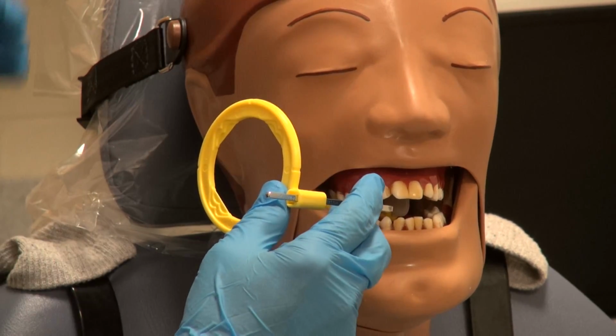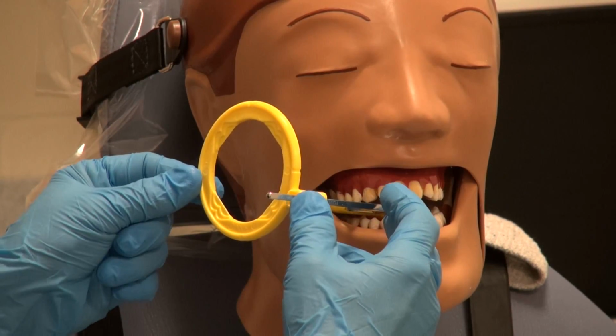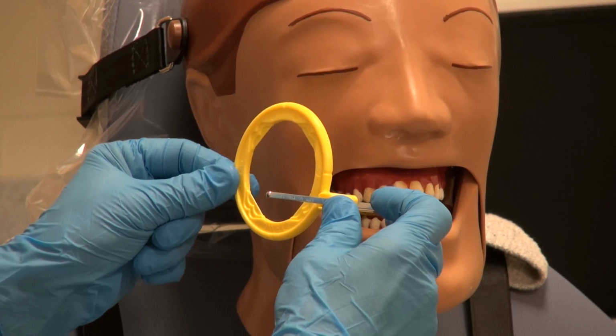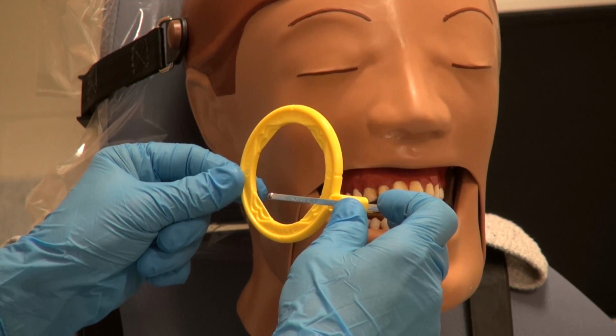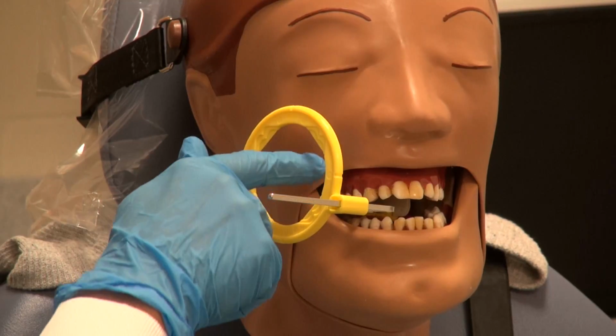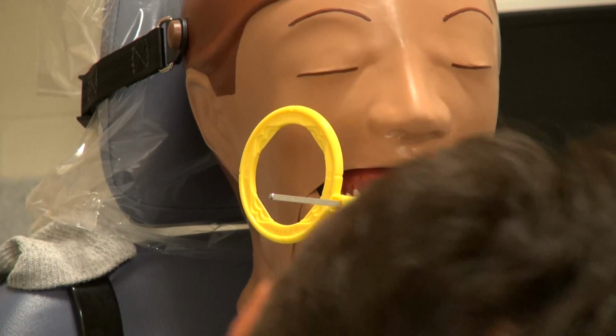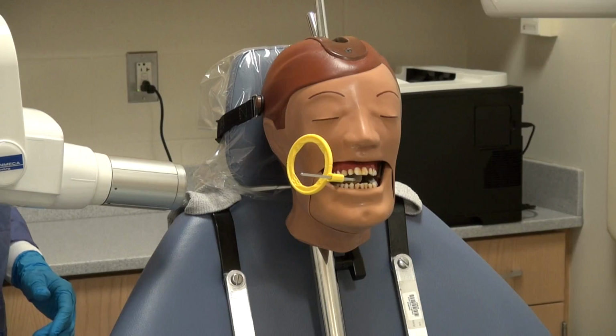The central ray should be directed through the contact area between the first and second premolars. The point of entry is the line from the pupil of the eye near the premolar root apices within the center of the ring. Check to make sure that the film is not bending against the palate and that it is parallel to the long axis of the teeth.